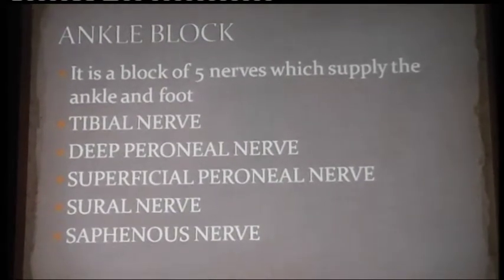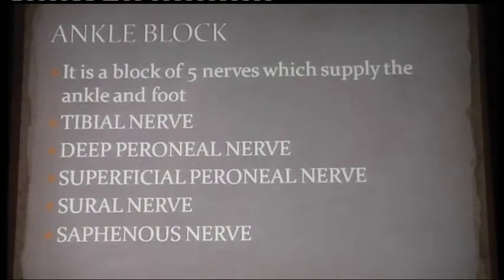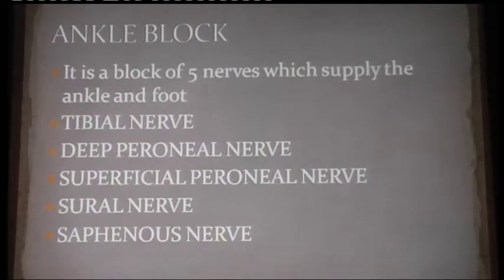Moving from proximal to the distal part of the leg, the ankle block. The ankle block is a block of 5 nerves, so you require injection at 5 points. So it's a sort of a painful block, but it is very handy, very useful in certain cases.